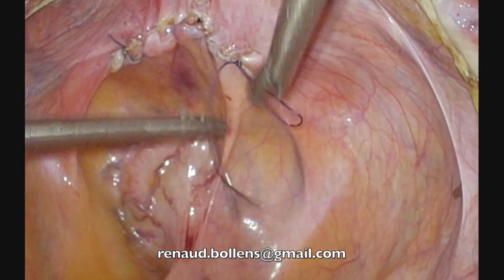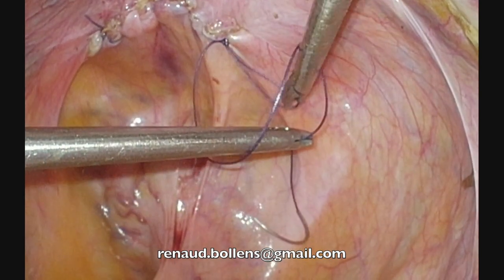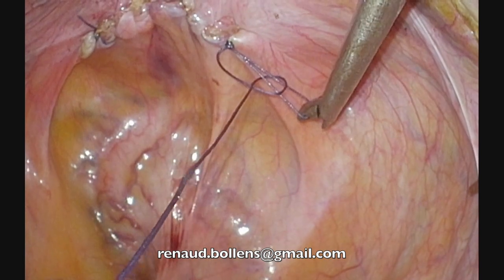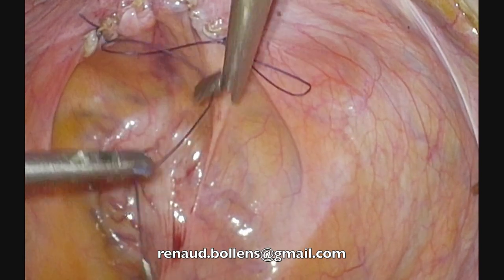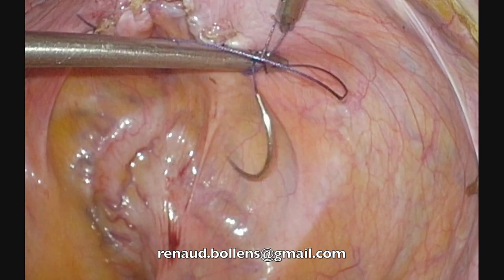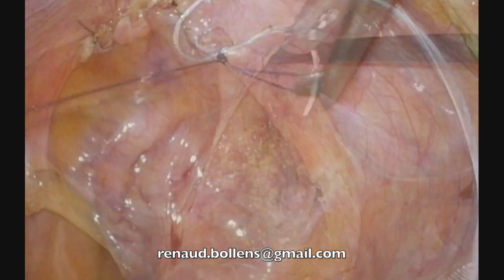Then the trick is just half loop. You take the loop, you jump over, and before you tighten, you open to have the same tension on both sides. Jump over, I open, and I tighten.